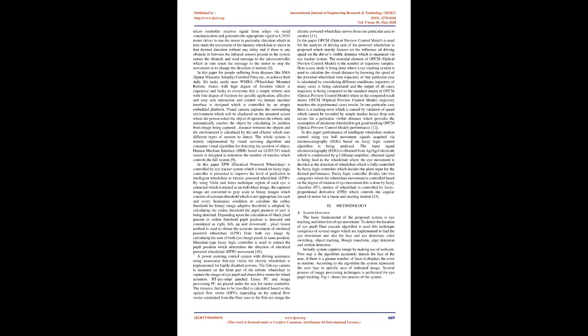A smart eye tracking system is designed for people with disabilities and elderly people. Wheelchair movement is mainly based on the eye movement. The camera is mounted on the person's head, which captures the image of the eye and processes the image by digital image processing with open source computer vision, OpenCV. The captured image is transmitted to a Raspberry Pi microcontroller to drive the wheelchair. The blink is regarded as the enter button on the keyboard to start the movement of the wheelchair. A servo motor is used to move the wheelchair in 2 dimensions and also to automatically stop the movements when there are any obstacles and change the direction of the wheelchair movement.